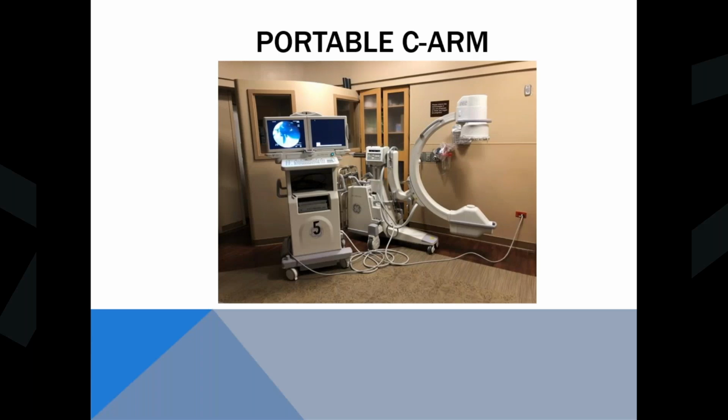One thing to keep in mind, one of the things that makes a fluoro system different from a conventional X-ray system is the collimator. The collimator in this case would be right under here. Some collimators can be really simple. In a normal X-ray system, you've got the 4 blades that come in that set your field of view, and if you're taking a picture of your wrist, it'll just have your wrist in the image.